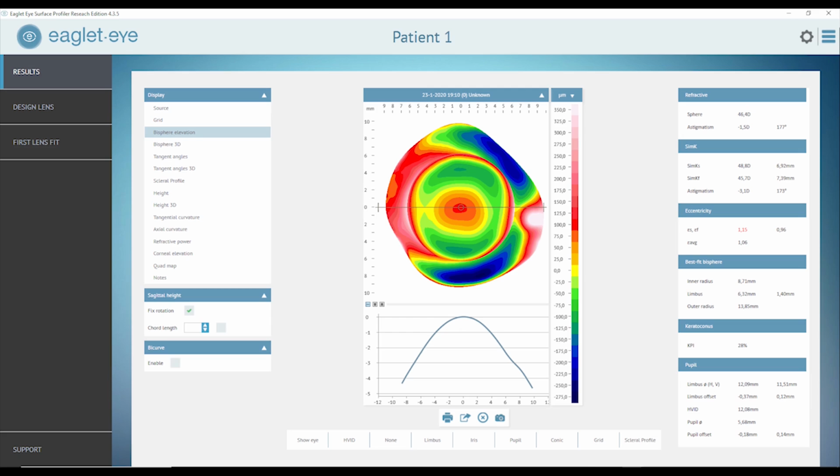With local elevations, I mean local elevations in the sclera, and most often we are talking about 1 or 2 pinguiculae. So start checking for a local red or white area in the nasal and the temporal area. Here the red ring is showing where you can find the pinguicula.